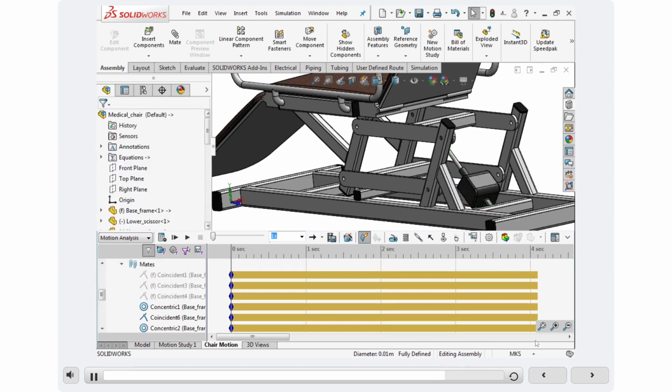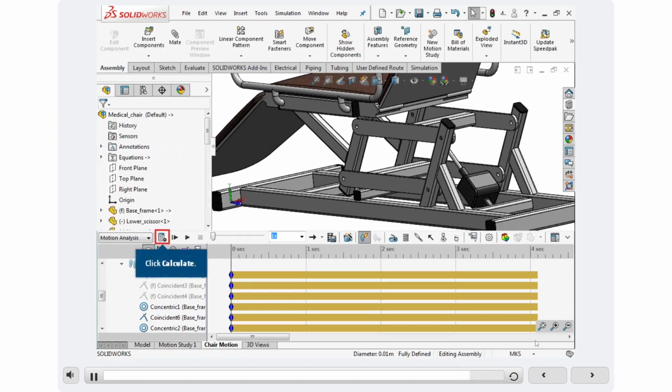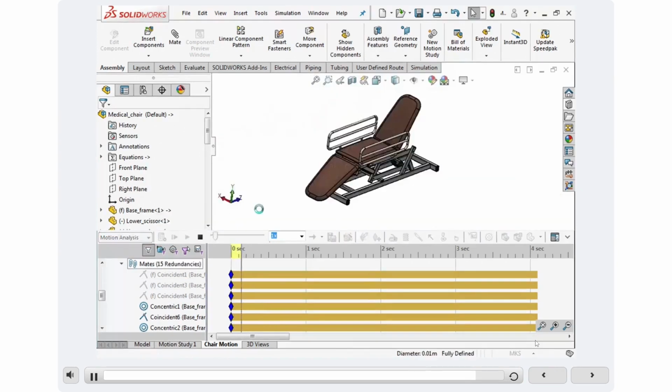Now, we will apply gravity to the assembly. Click Gravity. For gravity parameters, click -y as the direction and click OK. Click Calculate to run the motion study. Here, we can view the raising and lowering of the medical chair.